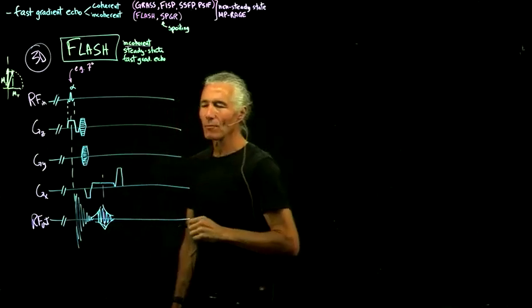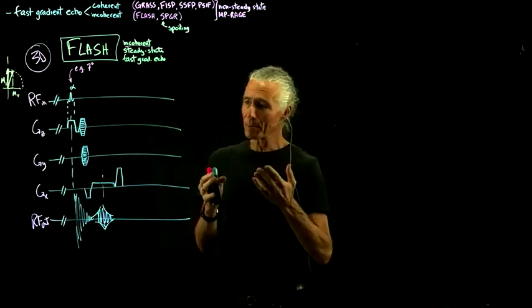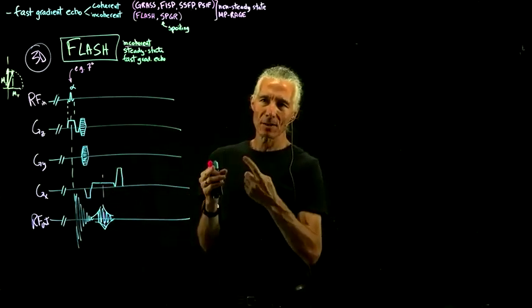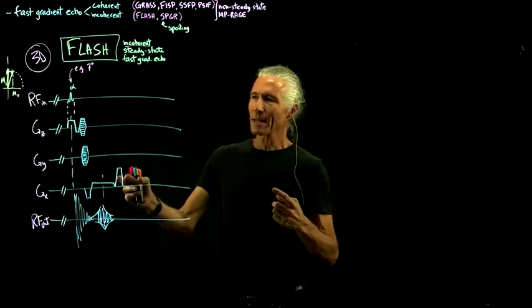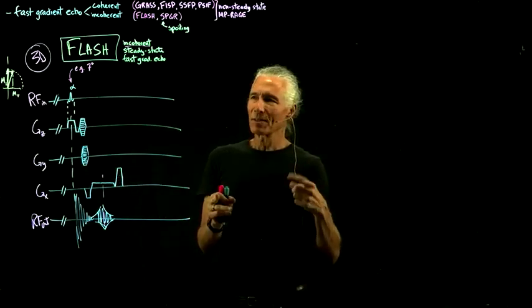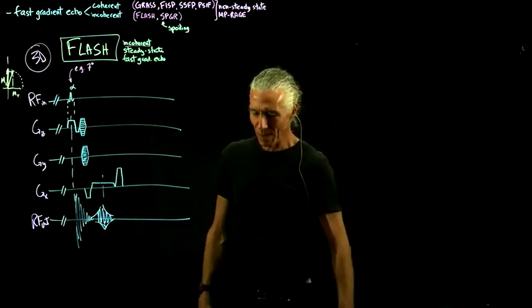So we could put like a really big gradient on, and what does that do? Well, you've got some magnetization stripes. You're at the right side of k-space, so maybe there's 128 stripes in spin phase going across in the x direction. What if you turn on a big gradient like this? It will wrap it up to 768 stripes or something. It's like a really high number of stripes. And what does that do?